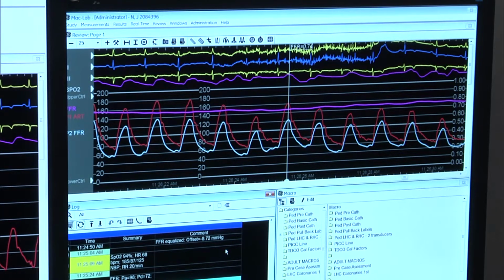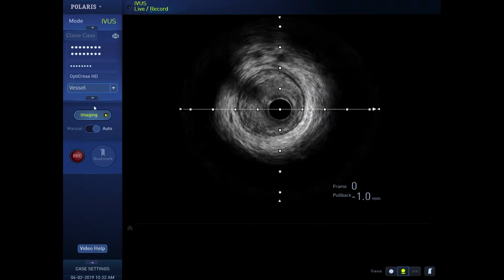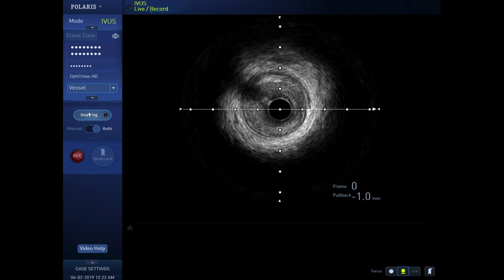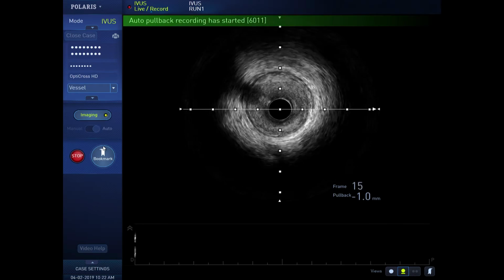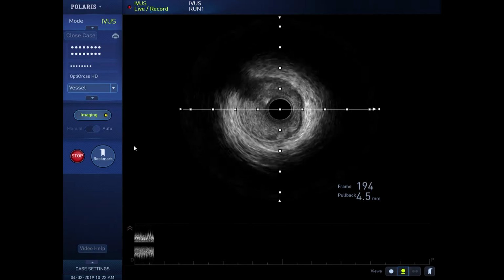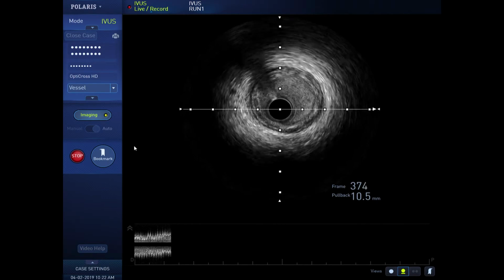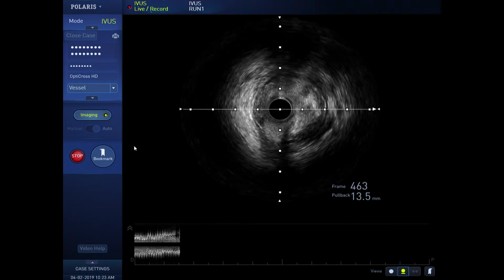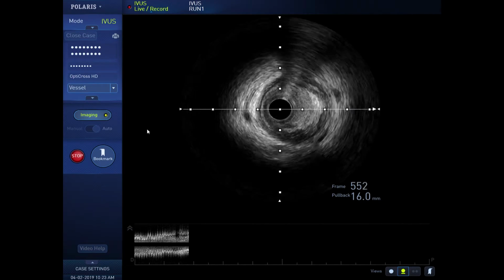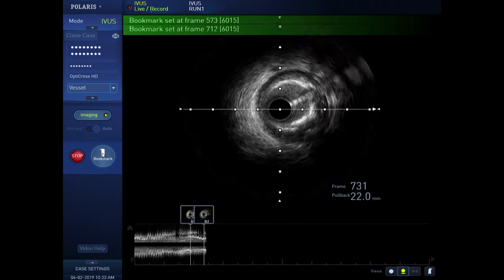these lesions. And when you have serial lesions, two lesions in the same artery, you want to see which one is important. So what they did is give adenosine intravenously to create a hyperemic response, and then measured the pressure, and you saw the differential between the proximal and distal pressure, and that there was a significant difference. Anything less than 0.8 is significant, and there's enough data to show that patients with 0.8 and less should undergo PCI. It's indicated, and that's exactly what they did.